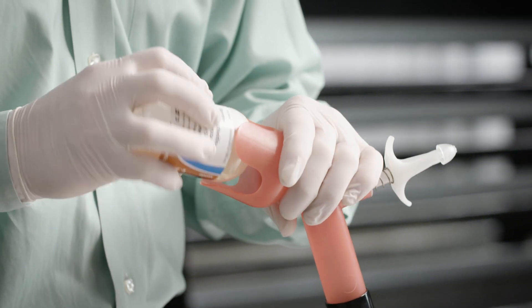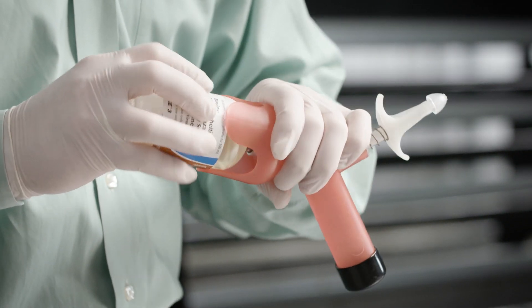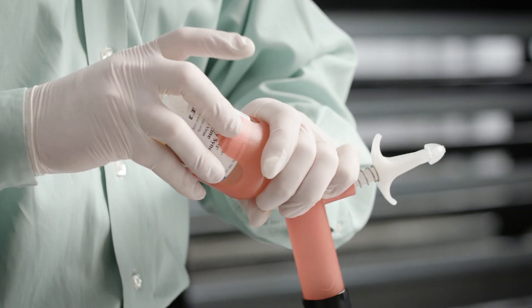Enforce 3 can also be administered with a pump-it device by placing a mixed 50-dose bottle in the slot and pulling the grip up to administer the vaccine.